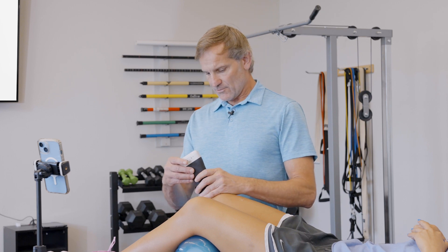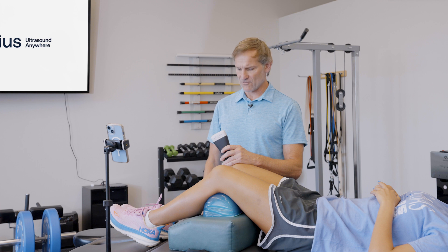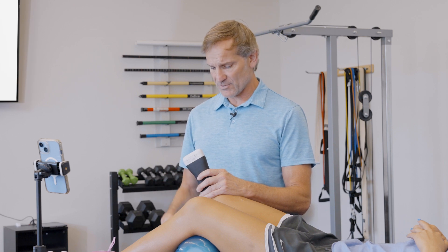We're going to use the Clarius linear probe to help guide that procedure. First, we're going to get the patient lined up supine with the knee bent at at least 30 degrees to put that patella tendon on stretch. Then we're going to line up the Clarius longitudinally, or in the lax position, along the length of the patella tendon.